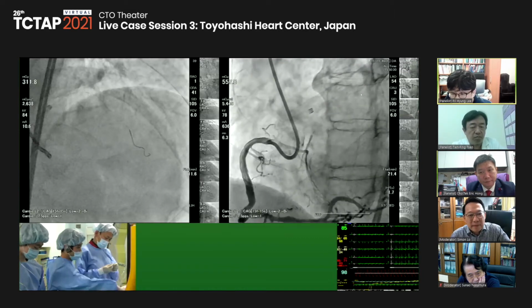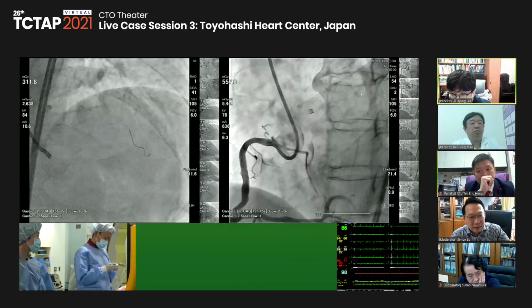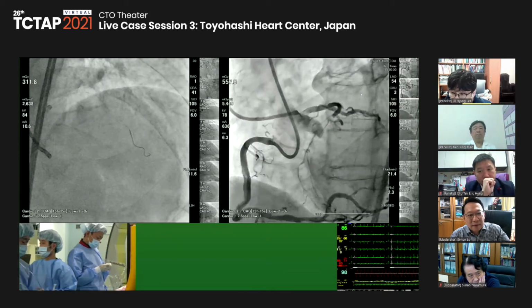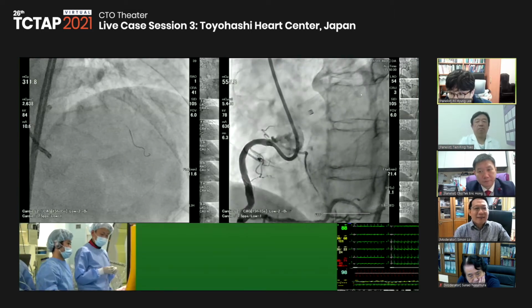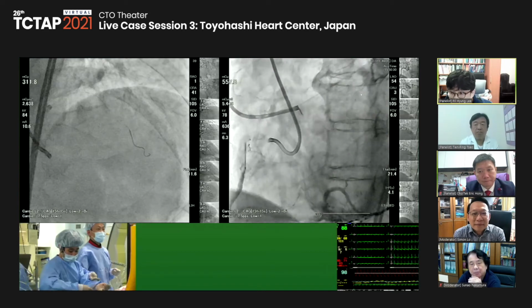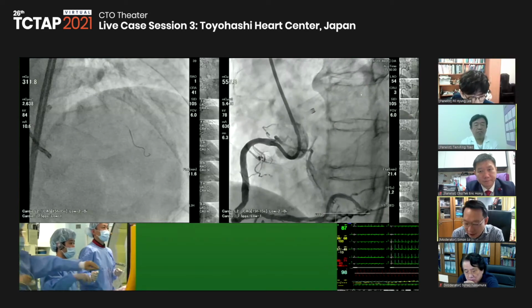Of course, considering that the CTO is a little bit short, I don't think that it is always easy, but at least we have the previous angiogram. I will start from antegrade in this kind of case. Okay. Dr. Eric Hong, please.